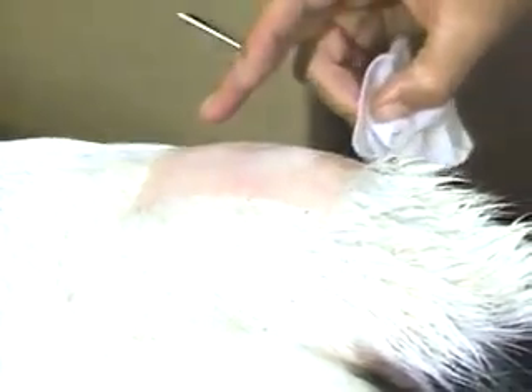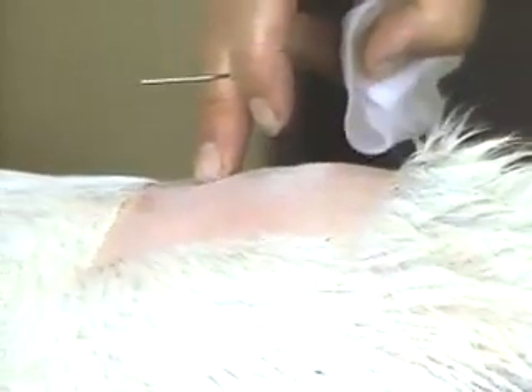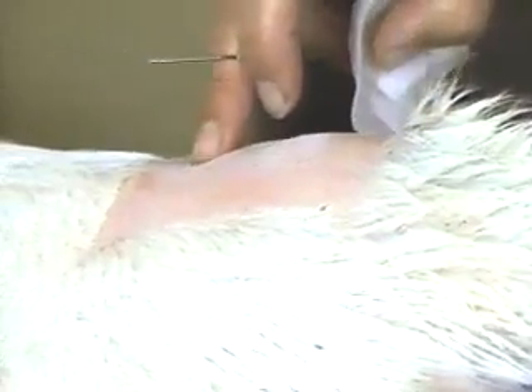It's best if it's clipped or shaved. The site we would like to use can be appreciated here when I move the tail — between the sacrum and the first coccygeal vertebra, or as an alternate, between the first and second coccygeal vertebra. The first joint where you can see some movement will be the sacro-coccygeal junction, and you can feel it as a little depression — an area that kind of compresses on your finger as you elevate the tail. That's the best site.